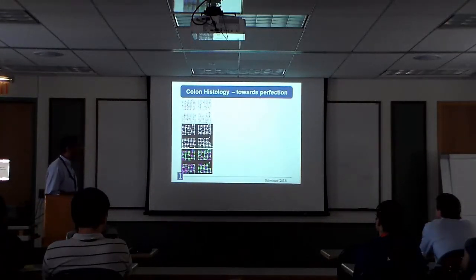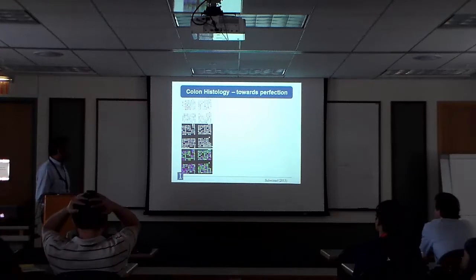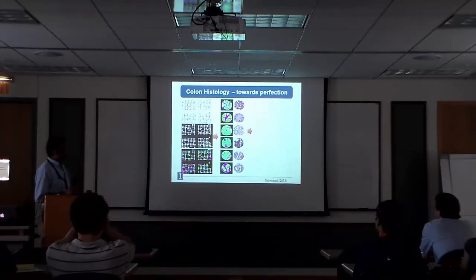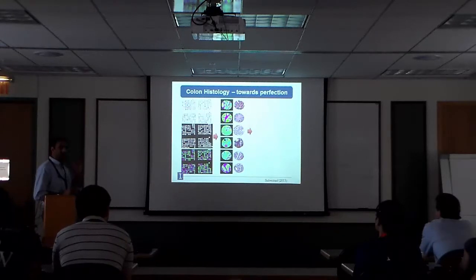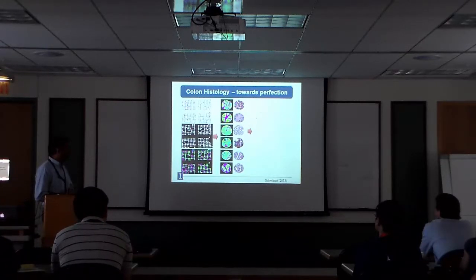So this is some data from last year. And what we've done here, that was prostate in the past, this is colon histology. And what we're trying to do here is only figure out where each cell type is, right? So it's not particularly complicated. We're just trying to say, can we find different cell types in this? And again, there's a color key here. But notice this new curve that has shown up here, and I'll explain what this is.